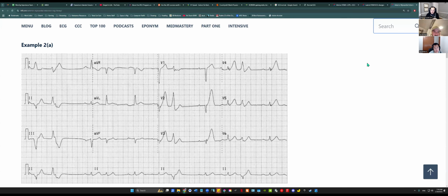Depression? Not quite. You almost have to discount this. Do you see how lead 2 shows up multiple times down here? This is the rhythm tracing. These are normal QRSs for the patient. This is a PVC. These are probably PVCs also. So that makes it so everything vertical to this, you almost need to throw out.